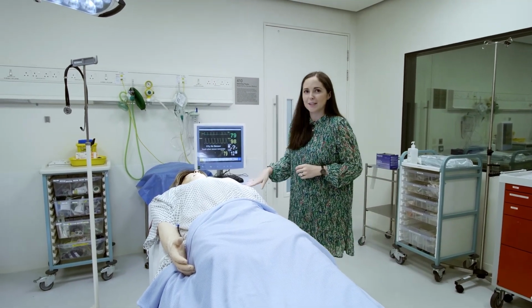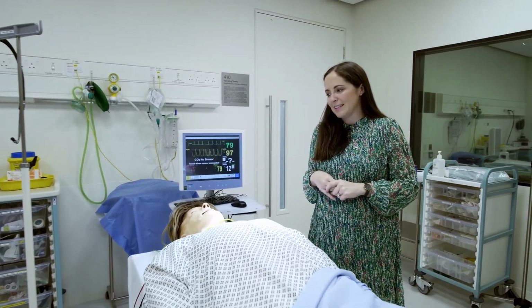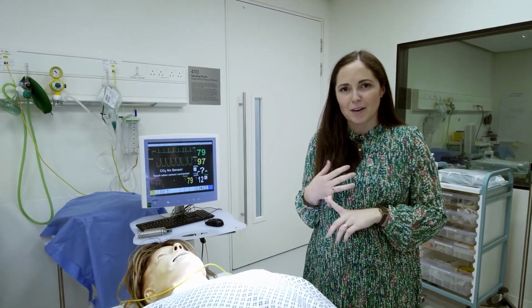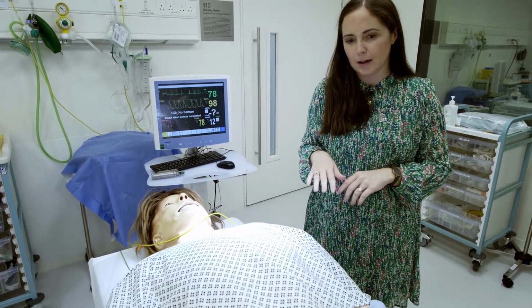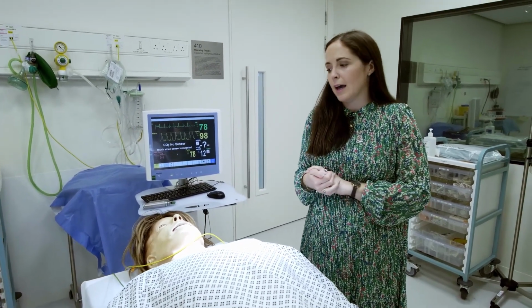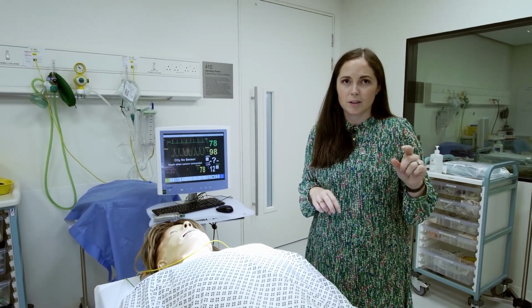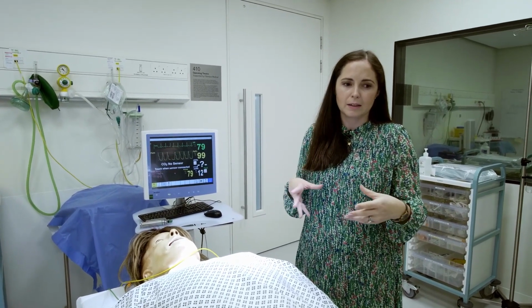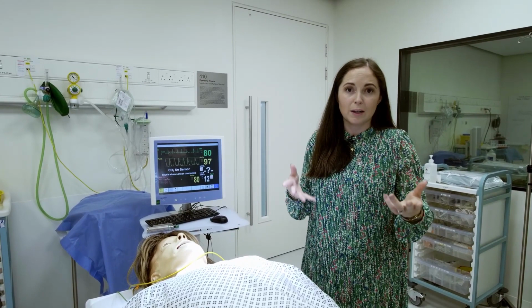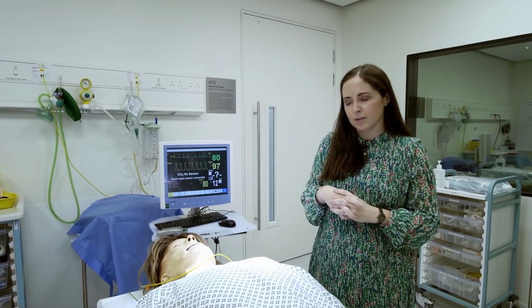Here we have our patient. So this is SimMan, one of our advanced mannequins. You can see him blinking there. His eyes react to light. He breathes. You can see his chest rising maybe a little bit there. You can check his pulses. And also the team are excellent at doing moulage. So we can apply bruising, we can apply scarring and lots of different things to give clues essentially for what might have happened to the patient or what the scenario involves.